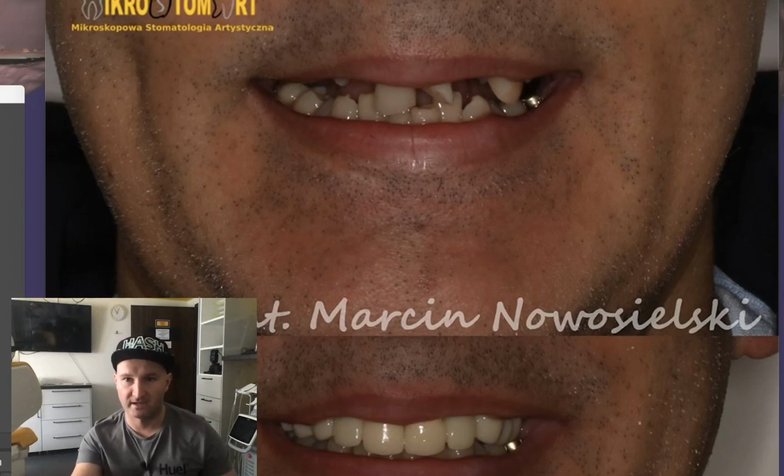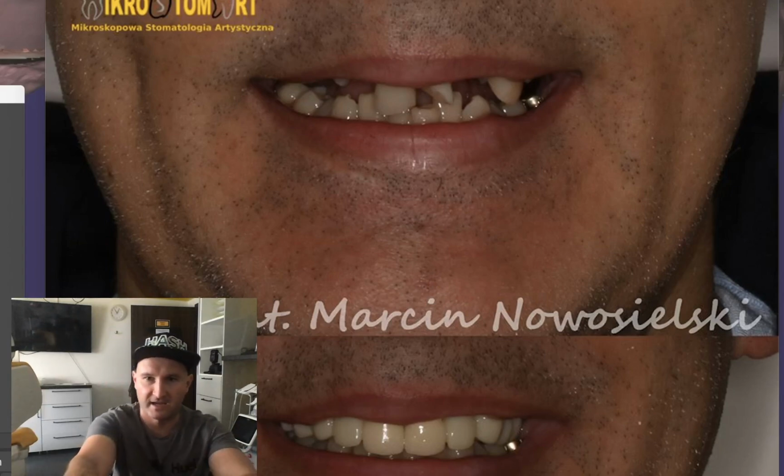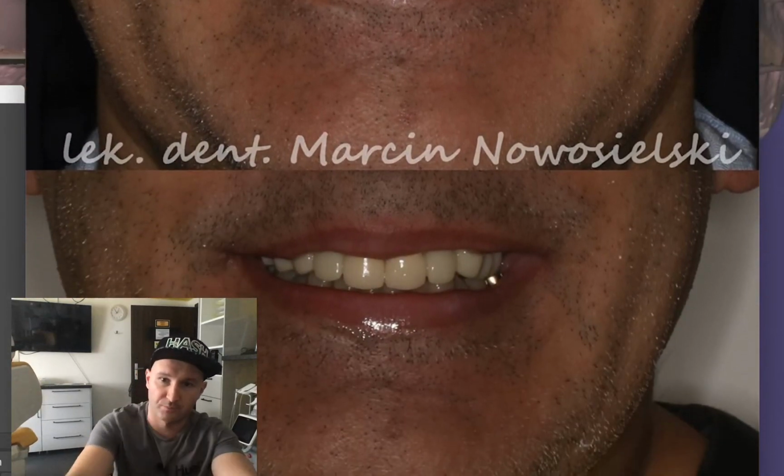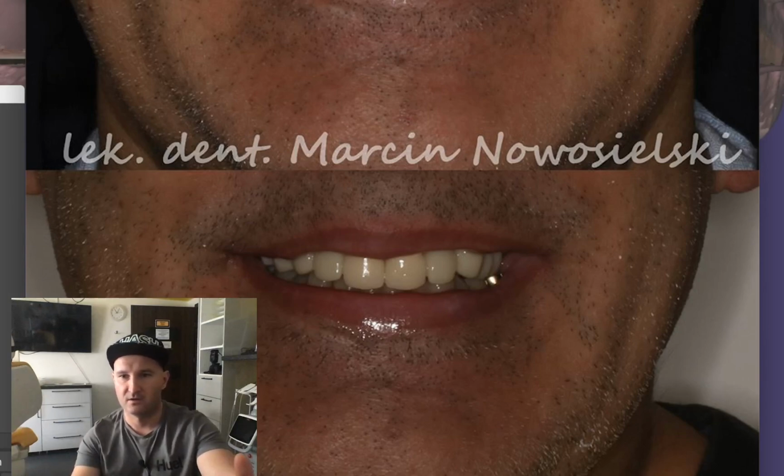But if you go like this, that you create and design your restoration in your computer, and you are equipped with a 3D printer, you are able to provide these results to your patient in maximum 24 hours. And he becomes much more motivated to continue with treatment.